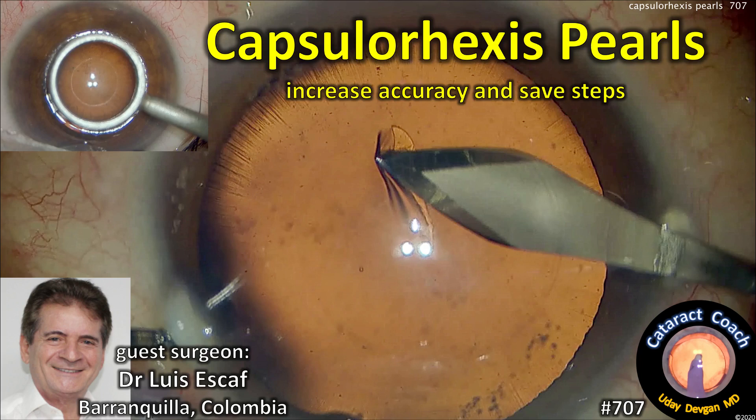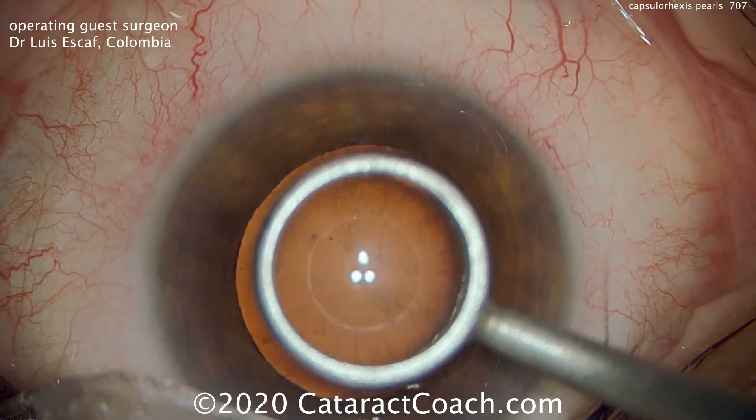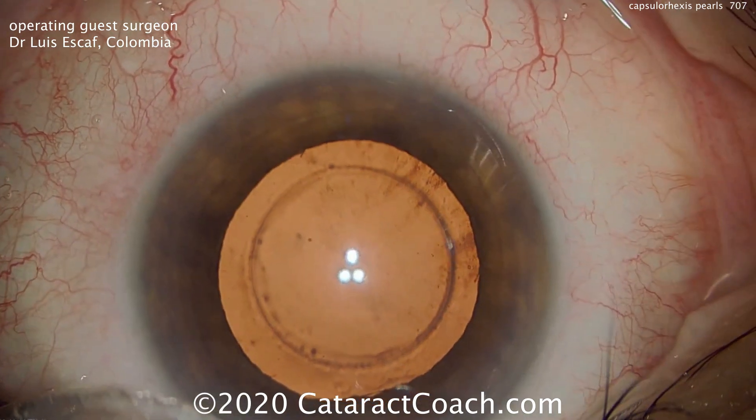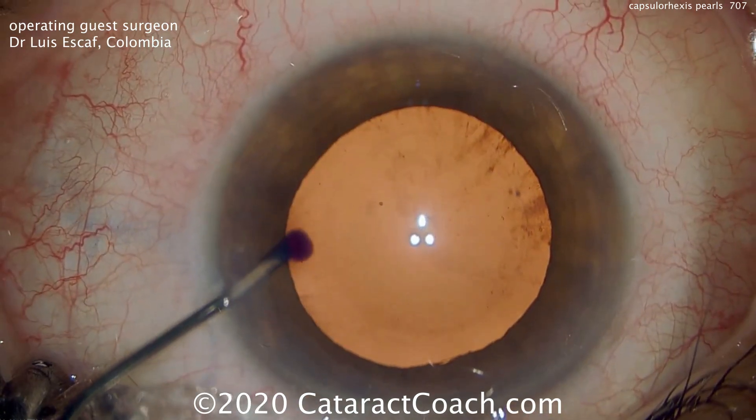CataractCoach.com, Capsulorhexis Pearls, with our guest surgeon Dr. Luis Escoff from Barranquilla, Colombia. First up is this ring that makes a mark on the corneal epithelium. That's going to serve as a guide to create the capsulorhexis.